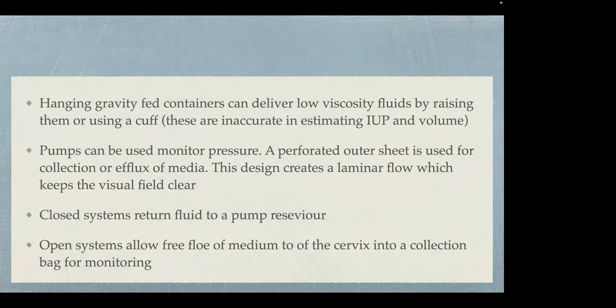Then we can use pumps that can be used to monitor the pressure. So these are pumps that show the pressure that you're putting in. And this point I've already said before, we have a perforated outer sheath which is used for collection of efflux of media. And so this design would create a laminar flow which keeps the visual field clear.